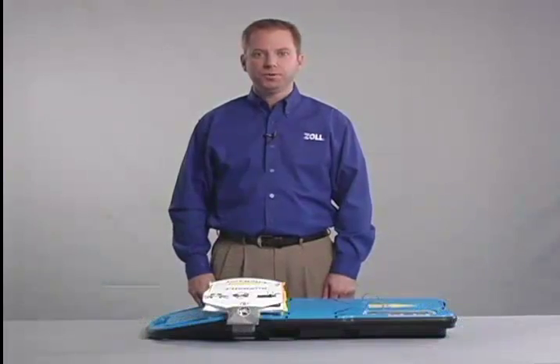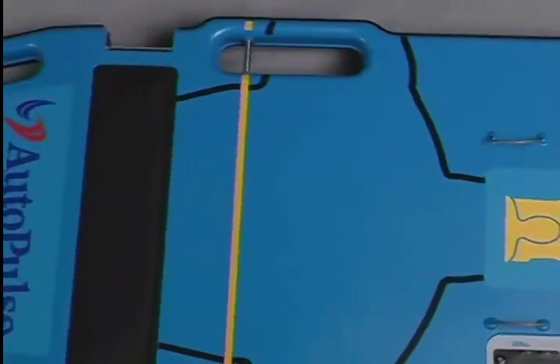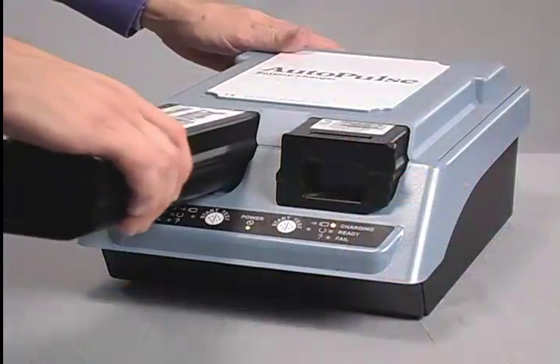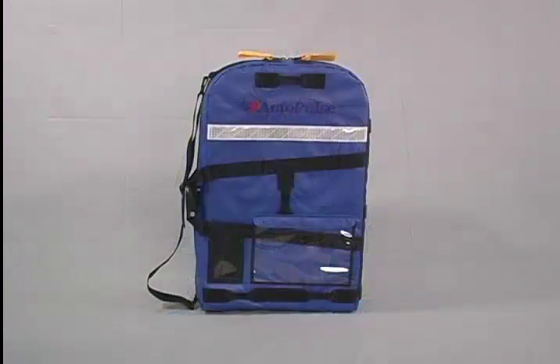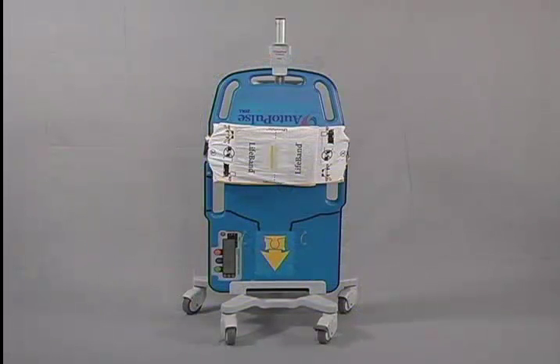The major components of the Autopulse system are the Autopulse platform, commonly called the board, the life band load distributing band, the battery and battery charger. Key accessories for transporting the Autopulse are the carry case for EMS and the transporter IV pull type device for the hospital.